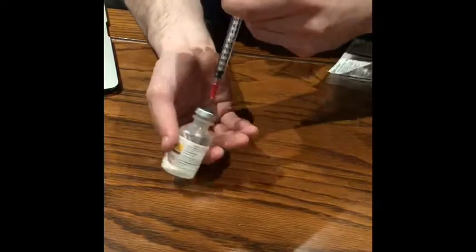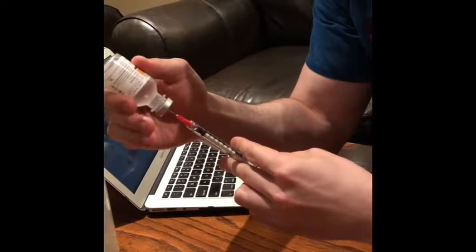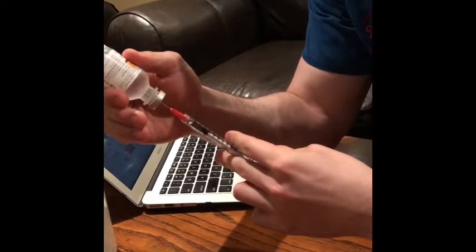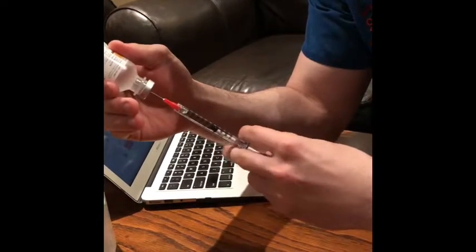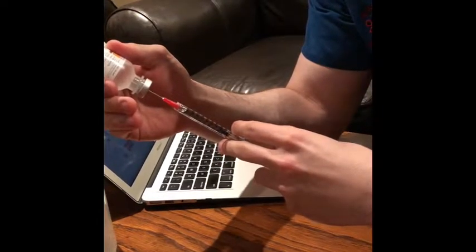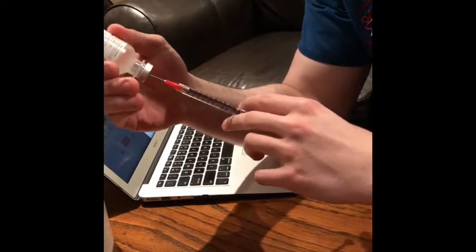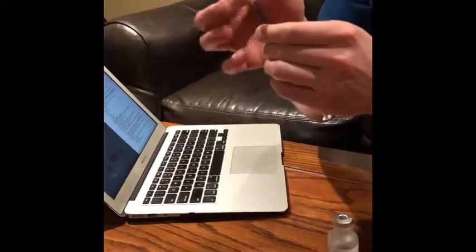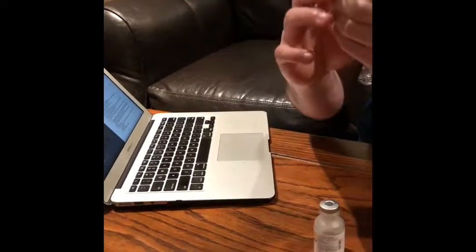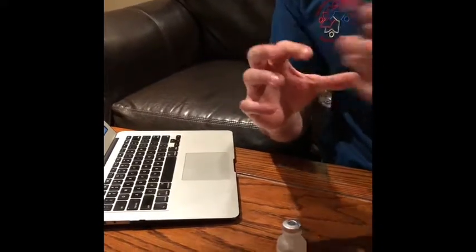And then we can flip our medication and make sure that the needle tip is submerged, and draw back slowly the medication to reduce the amount of bubbles formed. A little bit of bubbles there. And there we have our 1 milliliter.